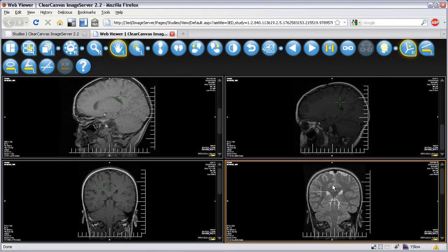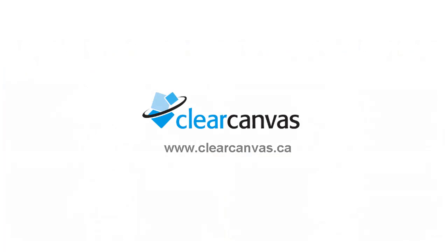That's how easy it is to view images in your favorite web browser using the ClearCanvas webstation and image server.